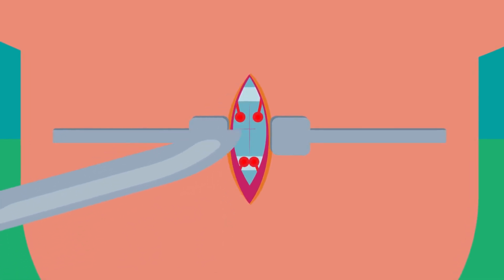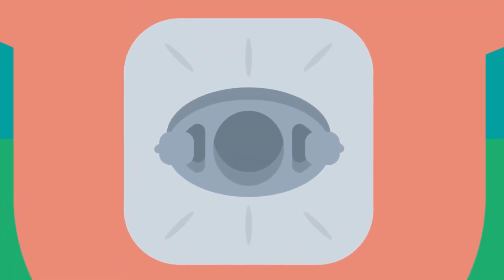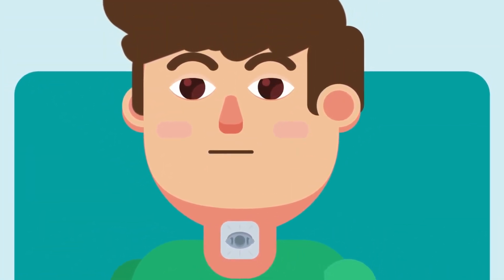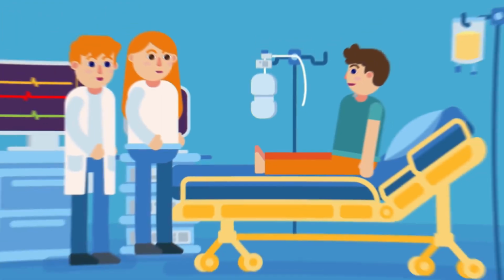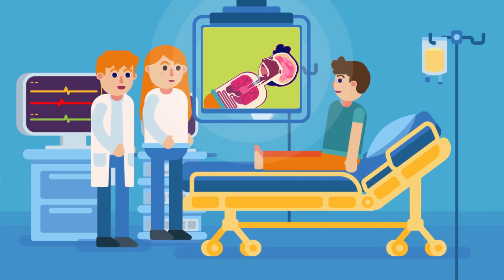Incision is given on the trachea. A hole is made and the tracheostomy tube is inserted, preferably through the second or third tracheal ring. The skin incision is closed and the tracheostomy tube is secured to the skin via stitches or simply tied around the neck. Care. After tracheostomy is done, certain precautions and care is required to ensure proper functioning of the tracheostomy tube and to prevent complications.